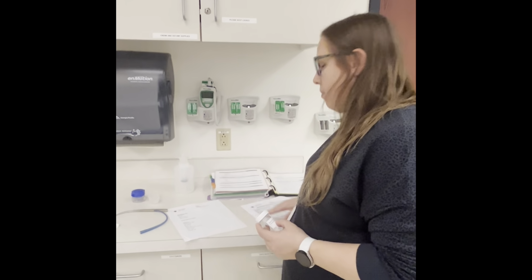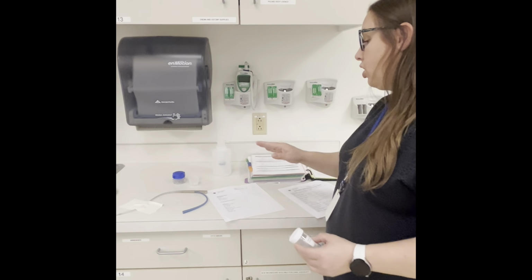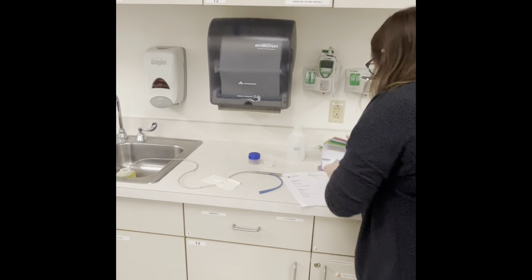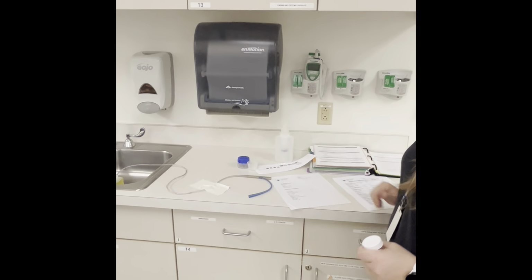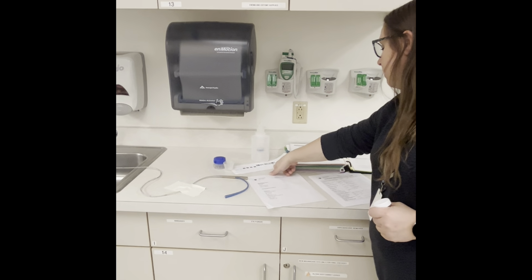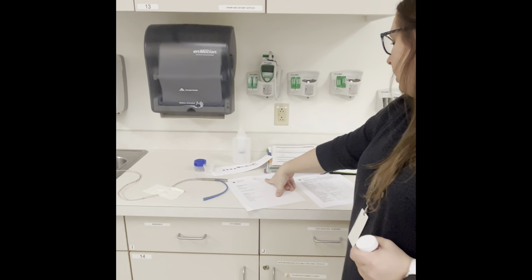Then again, we're going to compare for our second check. Then we're going to perform hand hygiene. We're going to look at our patient's name band. I just don't have one sitting here. We'll just pretend that one says the same. So we're going to look at our name band. All right. Dale Booth, 3/22/1953. Dale Booth, 3/22/1953. Dale, do you have any allergies? Yes to pineapple and sulfa.